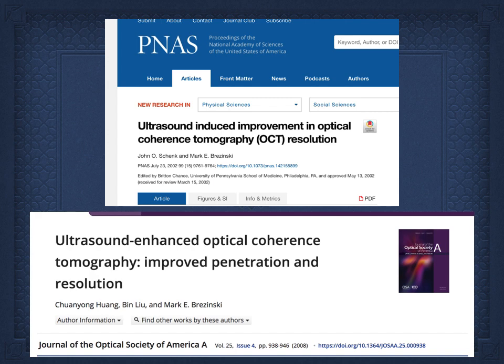But what happens is that an OCT system as a whole will filter some multiply scattered light. It's got what's called, for instance, a bandpass filter in it. So it blocks out frequencies or distorted light that's coming back. That's somewhat of a simplification. But now imagine if we have light going straight in and straight out, and we send an ultrasound beam parallel to it. The ultrasound beam will not shift the frequency of the light. I'm going to explain why that's important in a minute, because if you shift the frequency too much, it's filtered out.